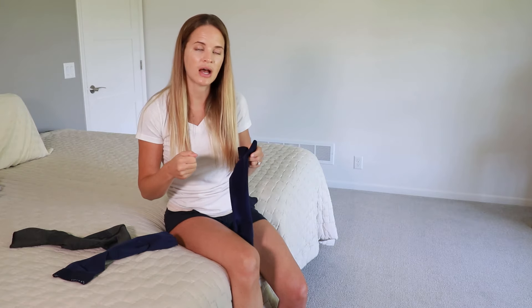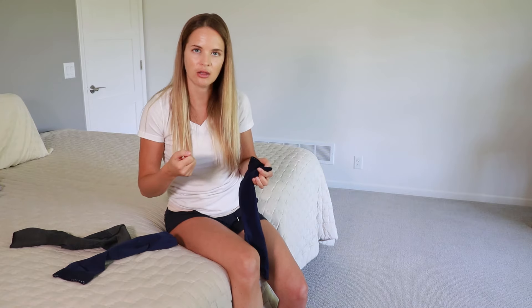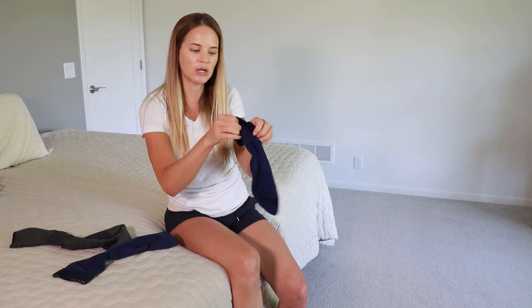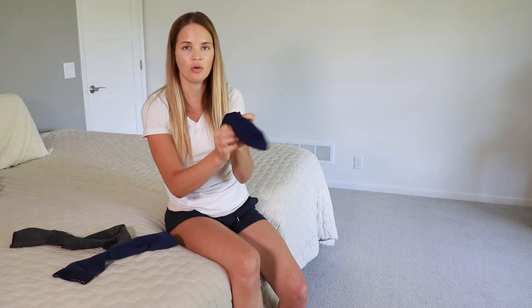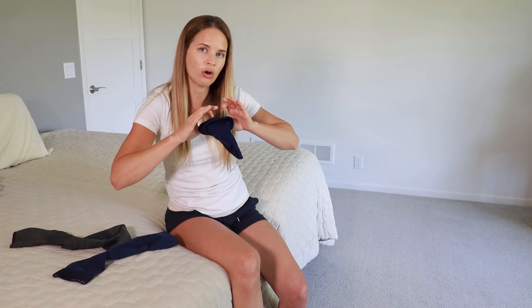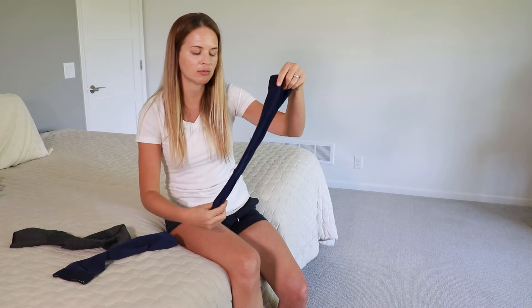If you just try to pull it on like a normal sock it's just going to stretch a lot, which makes it really hard to get the foot and ankle piece on. The other mistake I see people make is they'll try to bunch up the sock like they would another sock, but when you try to pull it on it's too tight. If you have too many layers with these stockings it makes it really hard to open up. So what you want is as little layering as possible.